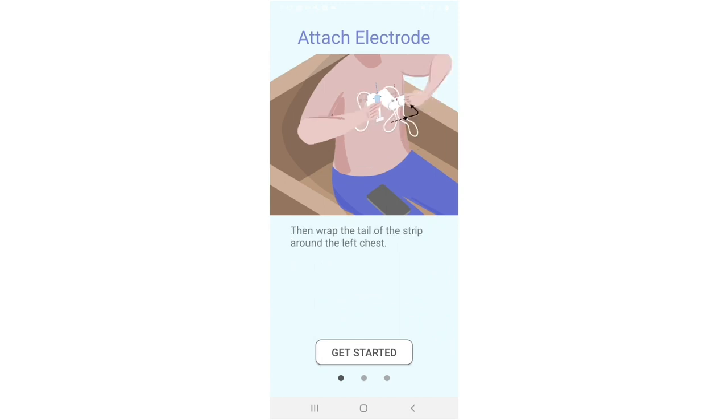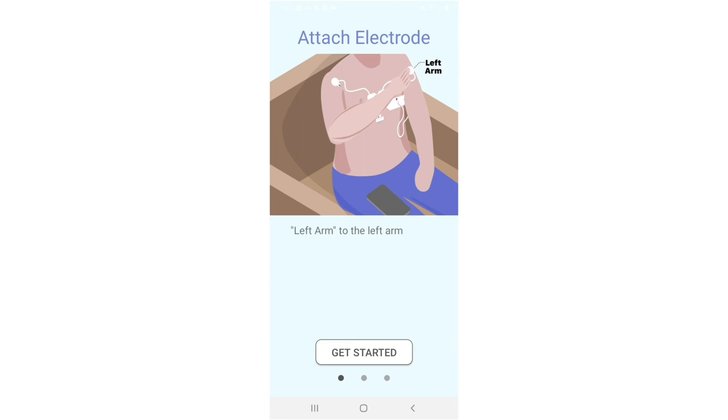Then wrap the tail of the strip around the left chest. Pull the electrode marked with right arm to the right arm, left arm to the left arm, and left leg to the left lower abdomen or upper thigh.